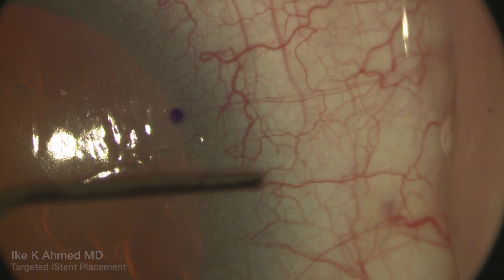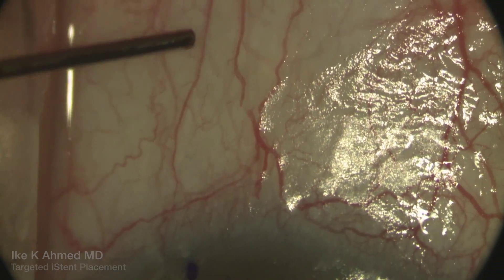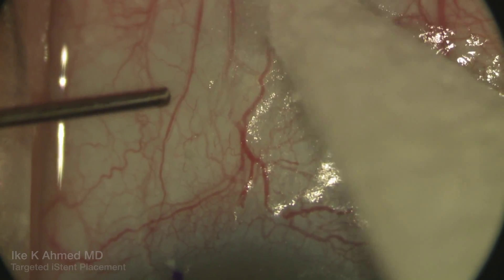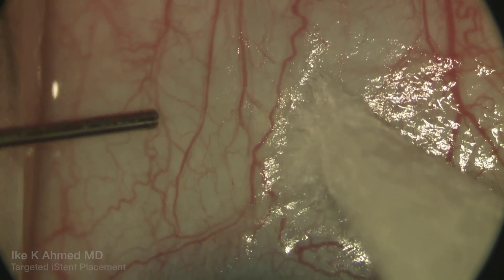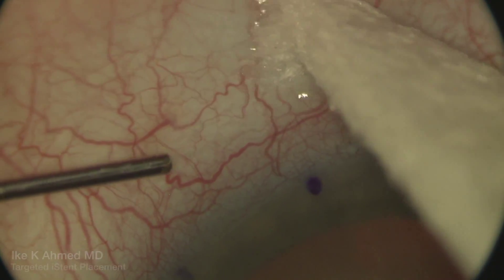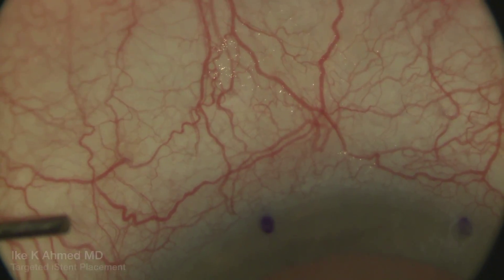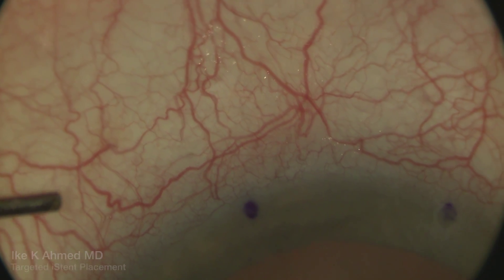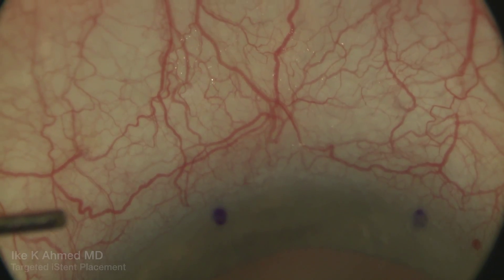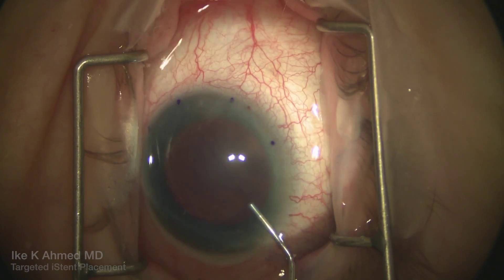The idea is to place these devices in the vicinity of those ostia as they come off the canal to preferentially drain aqueous through to the distal outflow system. Here we're also seeing a conjunctival vessel and some underlying episcleral vessels blanch after the injection of BSS, and the idea is to place these devices in direct proximity to those aqueous vein or larger collector orifices.